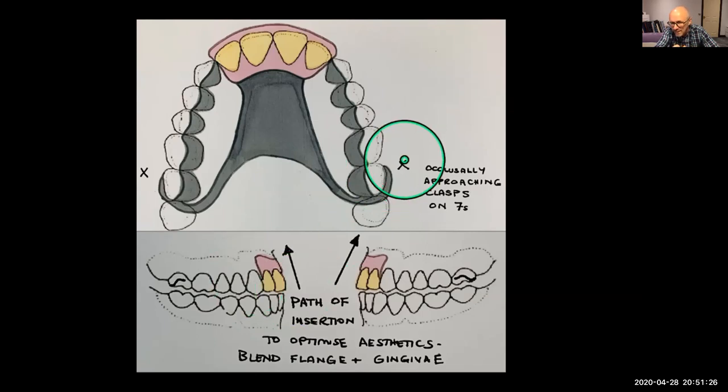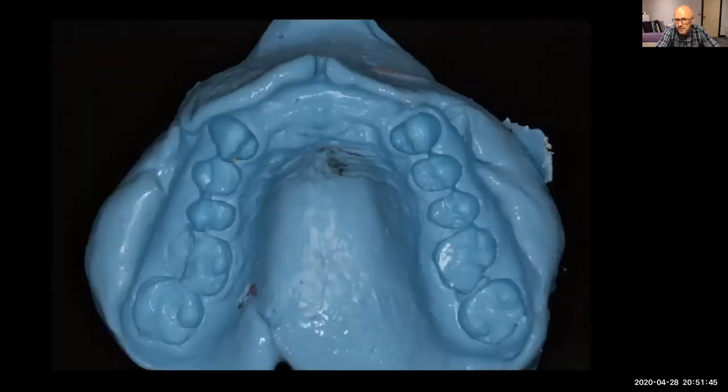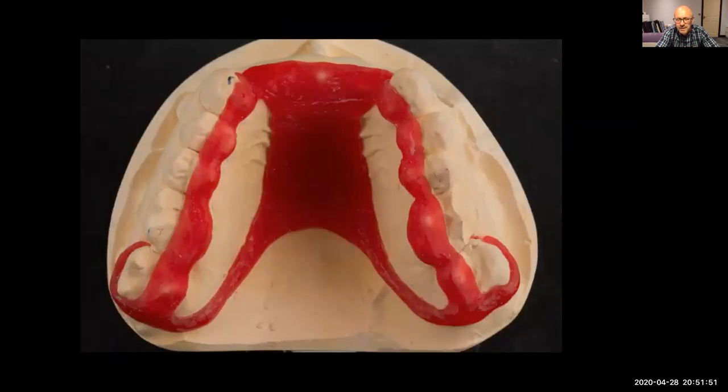And then the other thing is we've got 2 clasps per denture. Where I've put these X's, that's where we get retention. And so we've got an occlusally approaching clasp at the back there. So on upper dentures, I want the clasps as far back as possible. I'll show you how we actually go through this process. So impression, this is a special tray, alginate, beautiful. Look at the detail in there, the teeth.